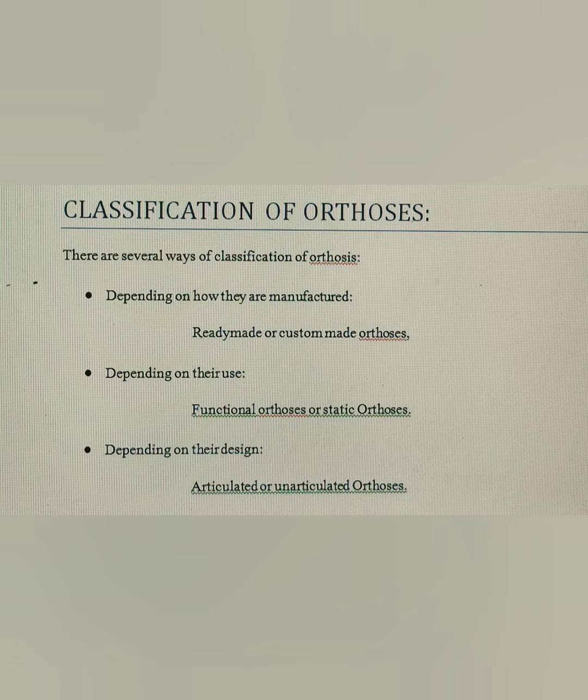If we classify them depending on their use, there are also two classes. Number one, functional orthosis, and number two, static orthosis. And if we classify them depending upon their designs, there are two classes as well. Number one, articulated, and number two, non-articulated.